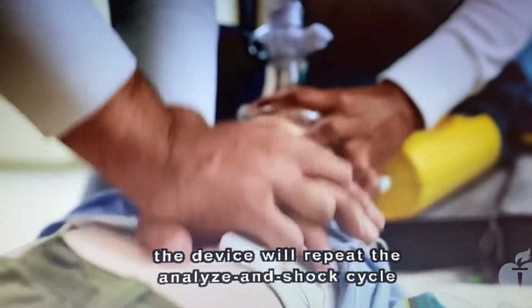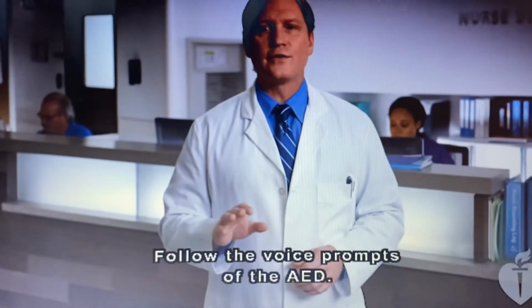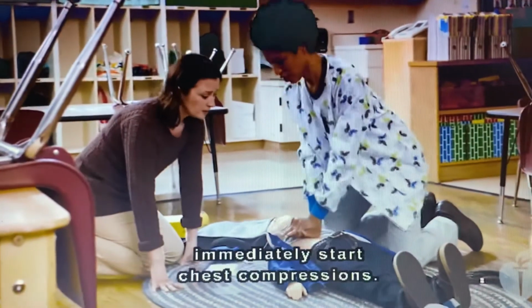The device will repeat the analyze and shock cycle about every 2 minutes. Follow the voice prompts of the AED. If at any time the AED indicates no shock is advised, immediately start chest compressions.